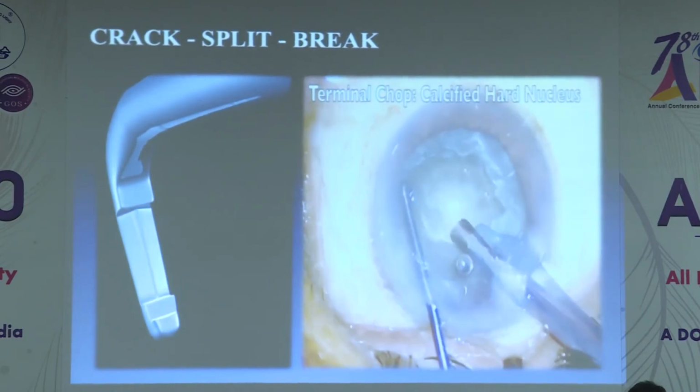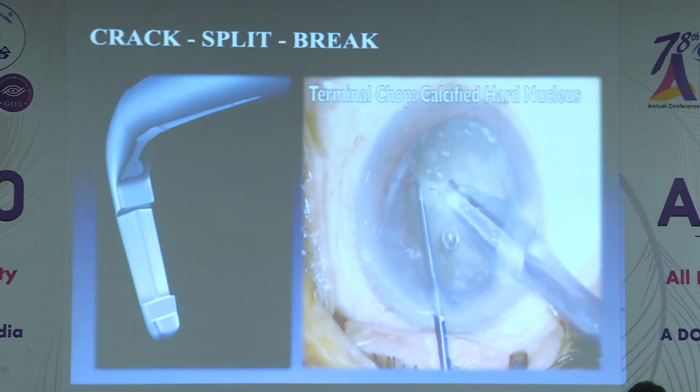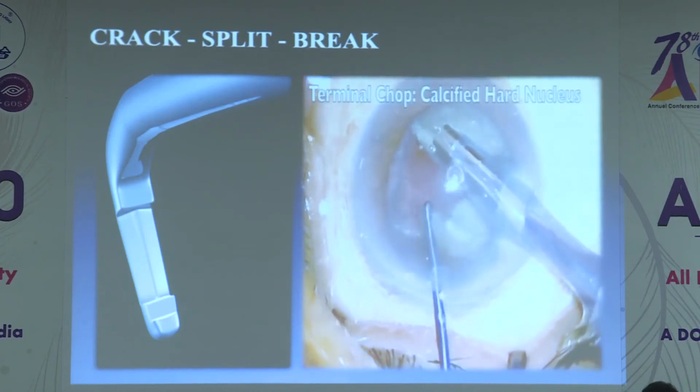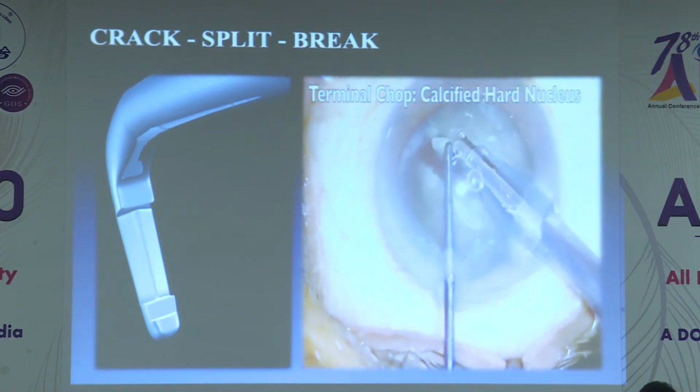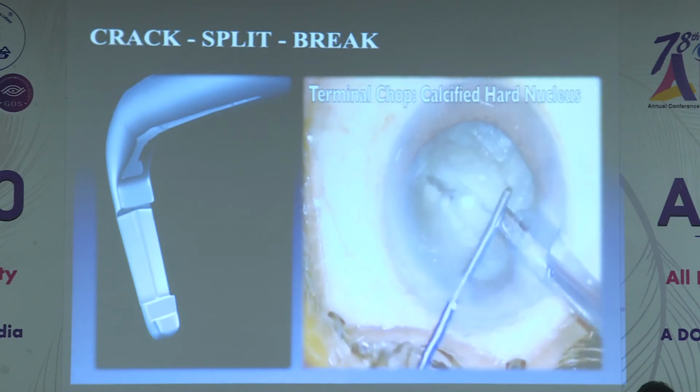See, you hold the nucleus, just penetrate from the center superficially towards the equator, hook it, and then draw it. So you get a crack. So you get a full cracking. The best part of this device is that when you're hooking it around, you'll get a complete full thickness cracking.